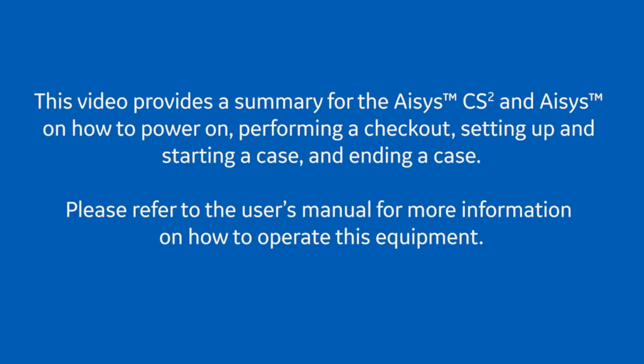This video provides a summary for the Aisys CS2 and Aisys on how to power the system on, performing a checkout, setting up and starting a case, and ending a case. Please refer to the user manual for more information on how to operate this equipment.